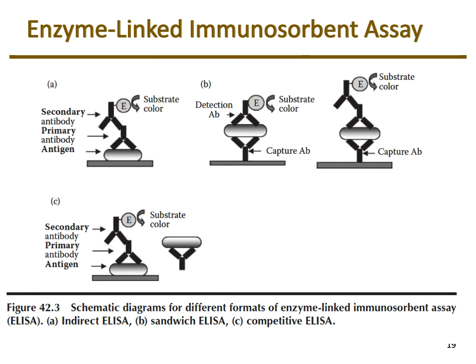So they're not, in general, unless they're running a kind of research program, they're not developing new ELISAs. So what they purchase is what they would utilize. The benefit of an ELISA is that usually these are in a 96-well format, so you can run a number of samples in triplicates at the same time.